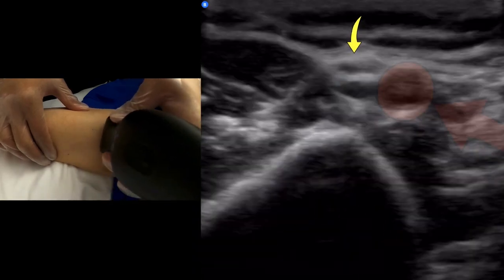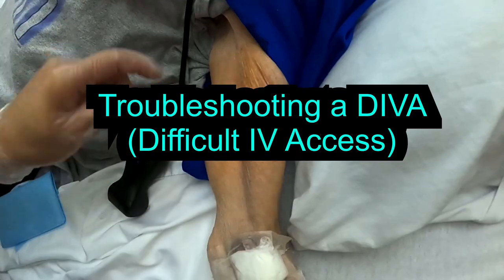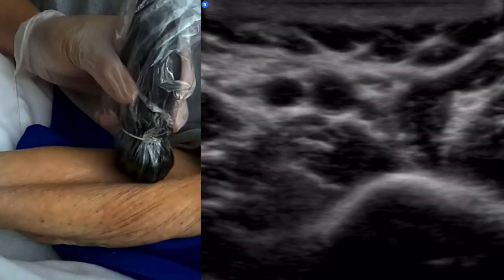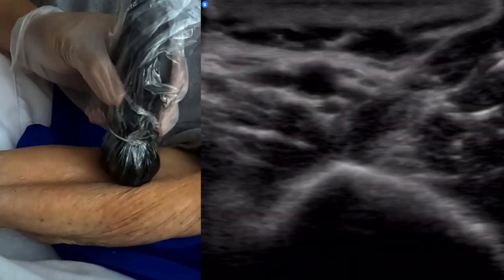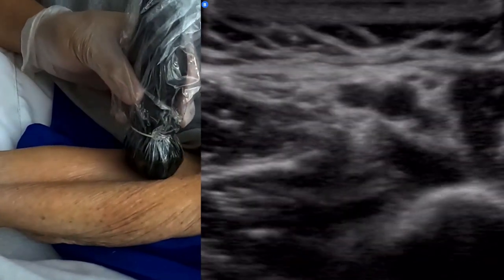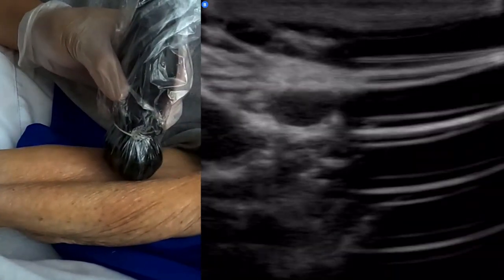I didn't like how that nerve bundle was right on top of that vein, so I decided to look in the other arm. All right, there we go. That's where I want to tap. I'm gonna go through there.